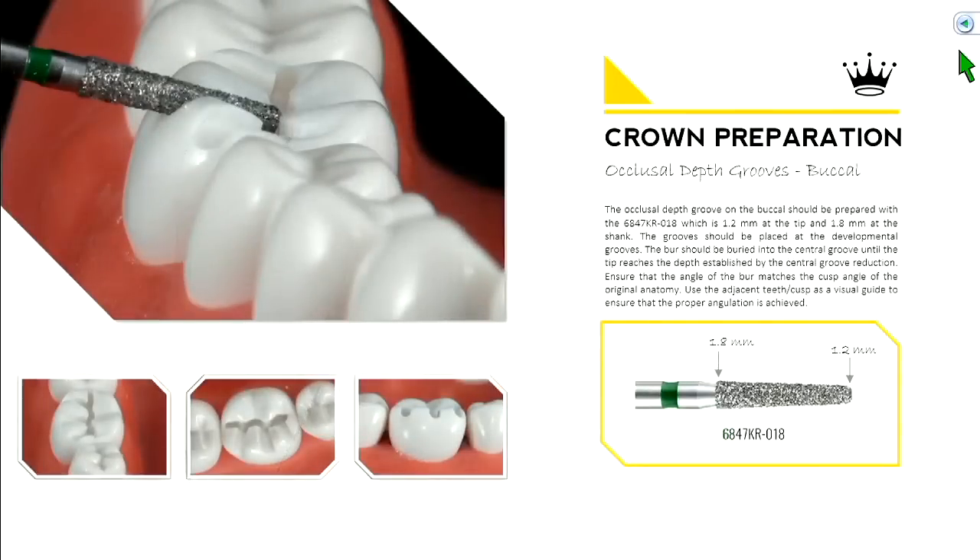Then we jump to occlusal depth grooves, starting on the buccal. It's helpful to establish these orientation or depth grooves before reduction, because if you just start reducing off the top, you quickly lose reference of where you started. If you place depth grooves, you can see the depth you want your reduction to end up, while still having enough original tooth surface to gauge whether the depth grooves were appropriately placed.